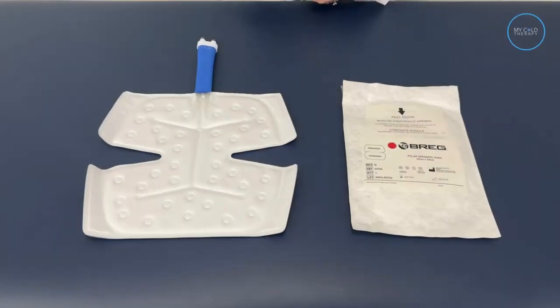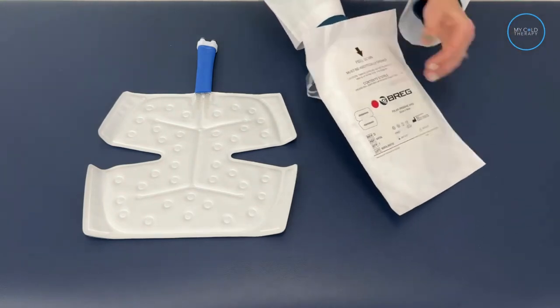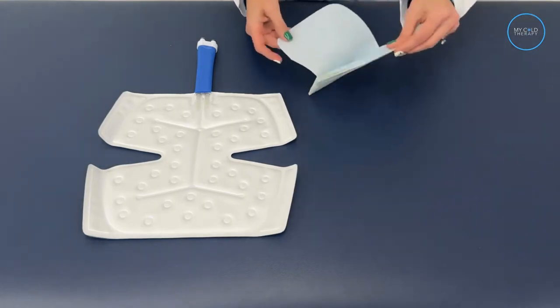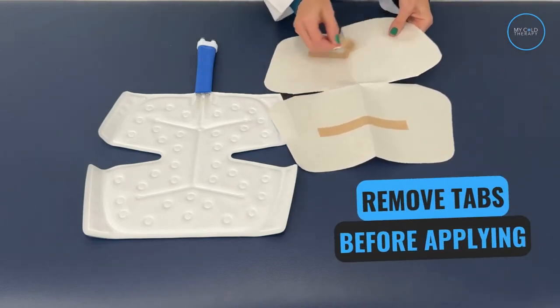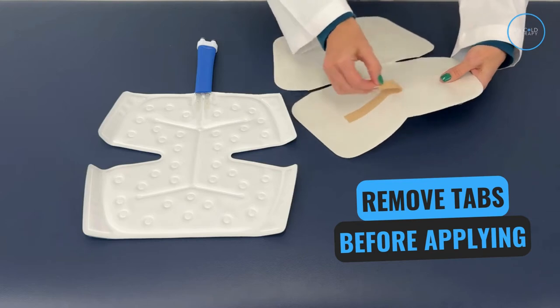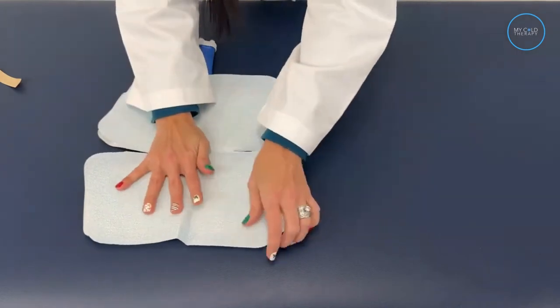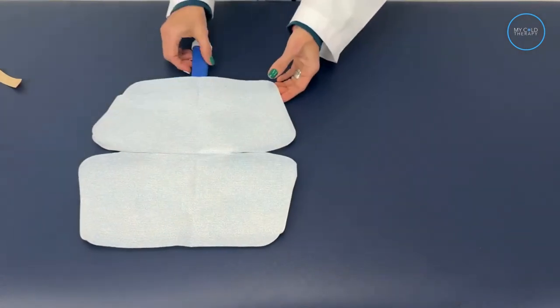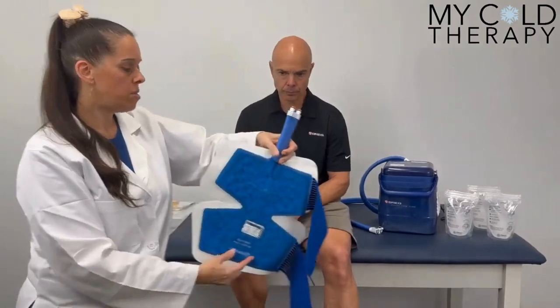To protect your skin, we sell sterile pads for each cold therapy pad on our website. You can also use a thin towel or a t-shirt, but please don't put the pad directly on your skin. They come in a sealed package, and this is how you apply them. First, you're going to open the sealed package and remove the dressing. Open the dressing up and you'll see tabs — go ahead and remove those tabs. Once you do that, you're ready to place the dressing onto the pad, and once it's securely in place, you're ready to apply it to your body part.